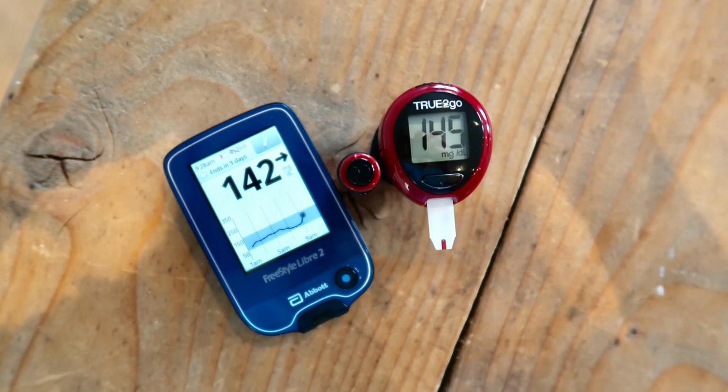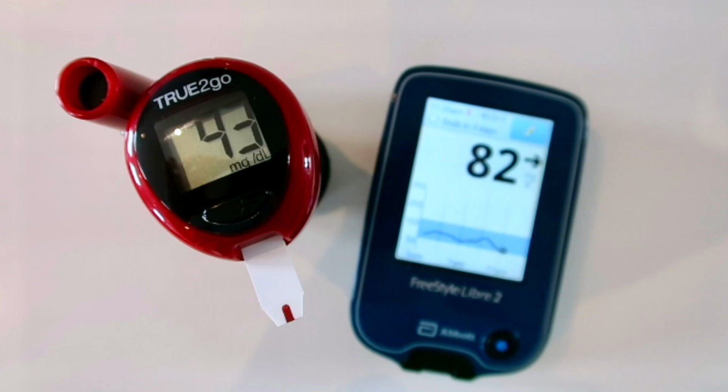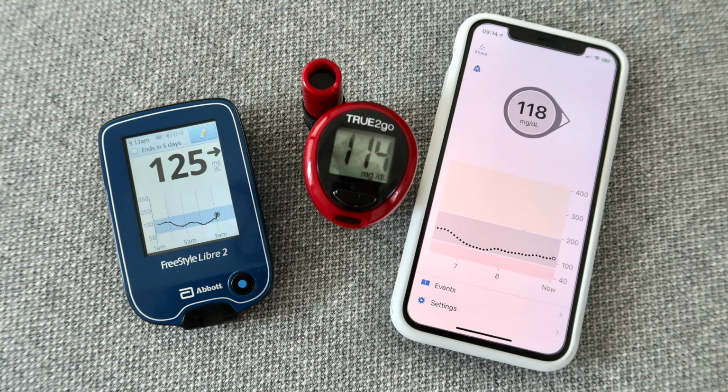I had very good results with the Freestyle Libre 1, and I had very similar and good results with the Freestyle Libre 2. There were some times where it was a little bit off, and I'm going to insert some photos here where I compared it to finger sticks. And a couple of times I compared it to my Dexcom G6, which is my continuous glucose monitor of choice and the one I use with my t-slim x2. So that remained on me during the time where I was testing the Freestyle Libre 2.